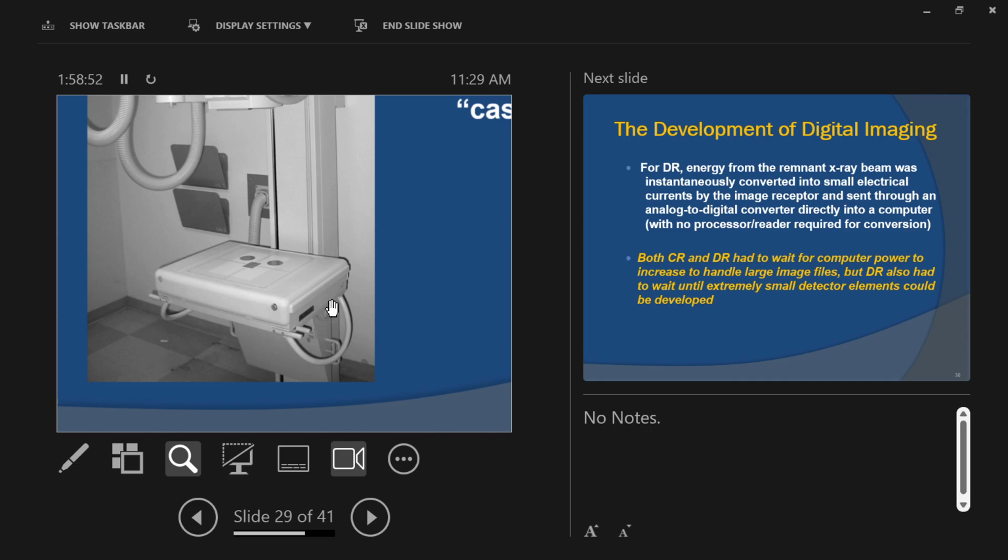There's all sorts of different things because you've got all these major manufacturers in the game trying to improve and be better than the other ones, right? Trying to have their own little gimmick that makes them better, right? And for all different applications too, different size rooms, different types of rooms, different types of medicine, right? Podiatric medicine, foot radiography, is its own special thing. We don't even train you for foot radiography. We teach you how to take foot X-rays, but not podiatric X-rays, which are a totally different, weight-bearing type of thing.